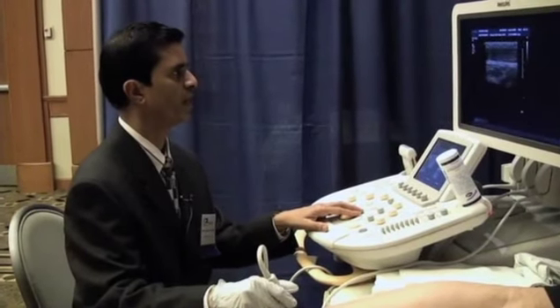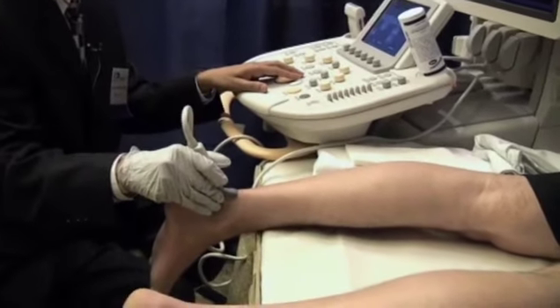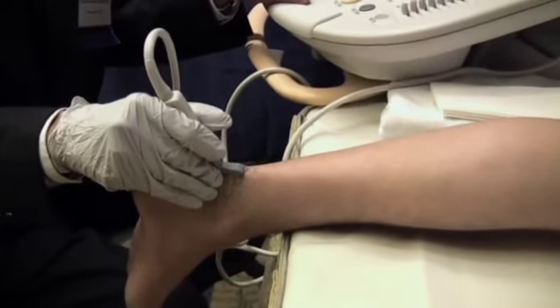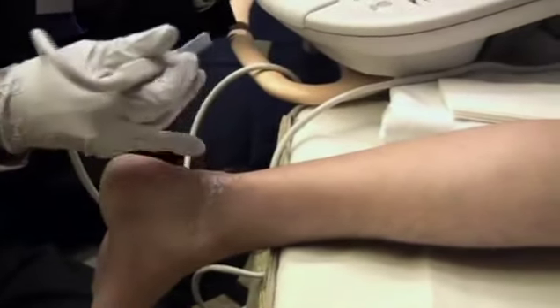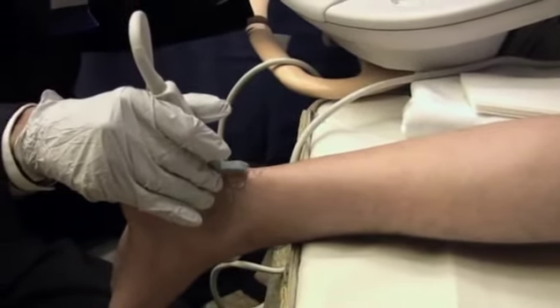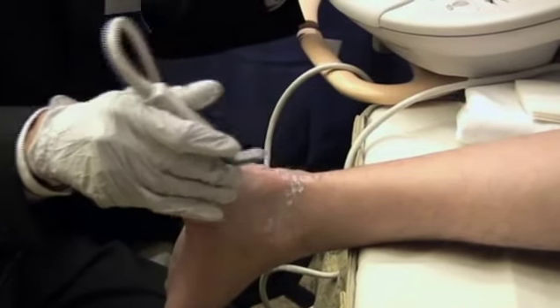The way we scan the ankle is with the patient in the prone position, lying down flat on his belly, with the foot hanging away from the table. This way you can scan most of the posterior, medial and lateral, and it's easy to compare with the other side. Once you're done with the posterior, medial and lateral, you can have the patient sit up and do the anterior portion.